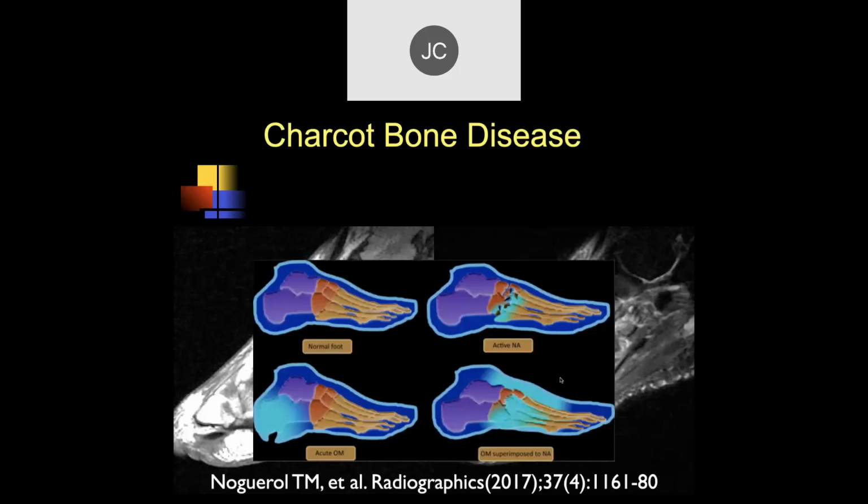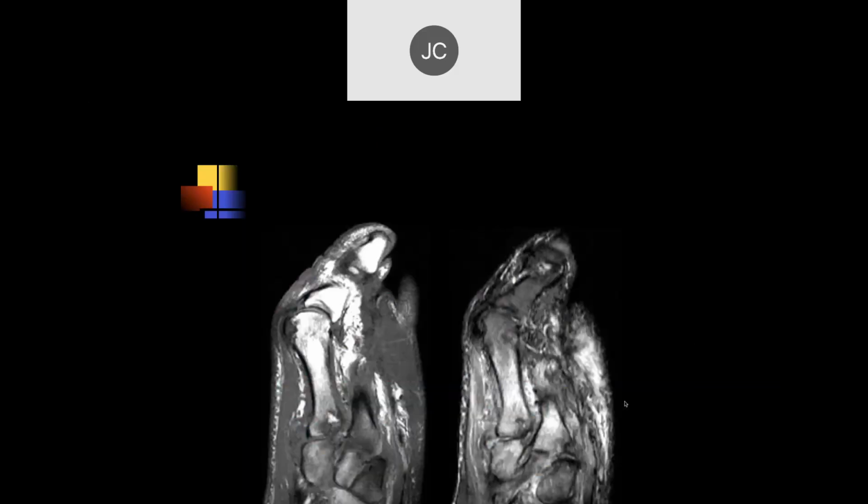And then, so this is, I don't know, I guess I got this from a particular paper where they were trying to differentiate these, and this is kind of our condition here. I don't know. Forget it.